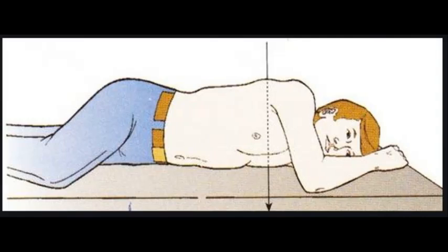For these procedures, I typically work on the left side of the table. Our rooms are already built out with easiest access from this side of the table. So with me on the patient's left and the patient in the LAO position, the back is obliqued slightly towards me, which gives me a better visual of the back and easier access to the skin entry site.